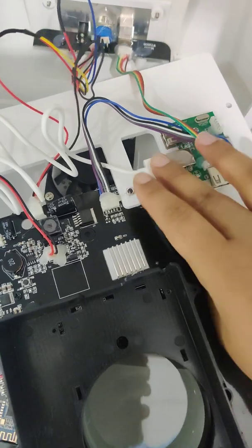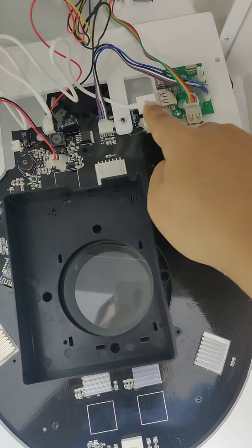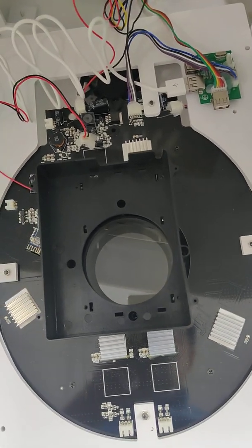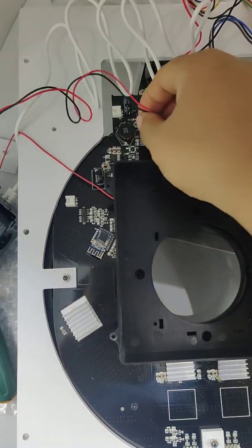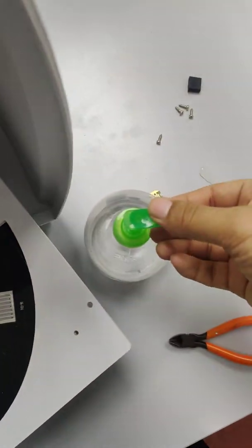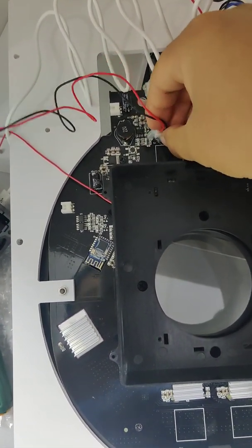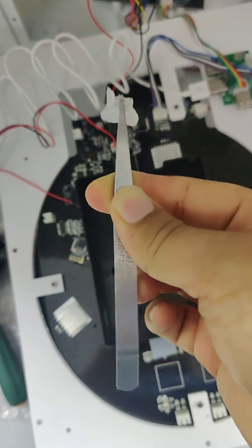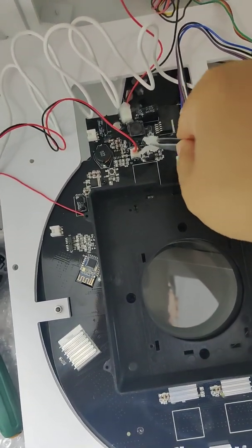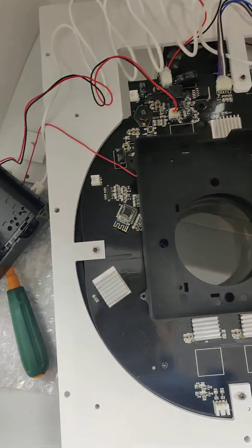Look. You can see I take off the gel on this connect port. Use the alcohol. Okay. And also we need to use some alcohol and put on here, so we can take off these gels. And also we need to use a tweezer to take off this gel. Okay. We put it on the desk.